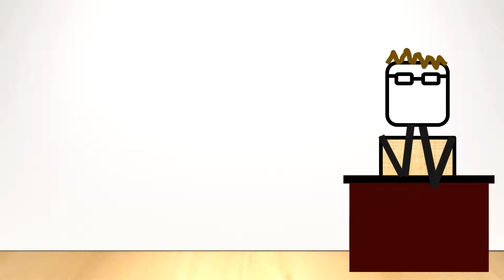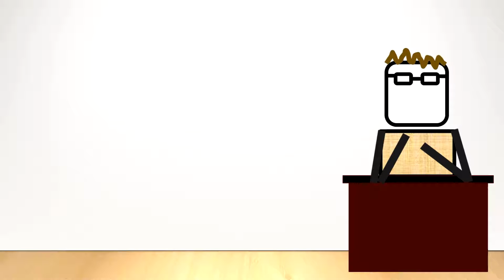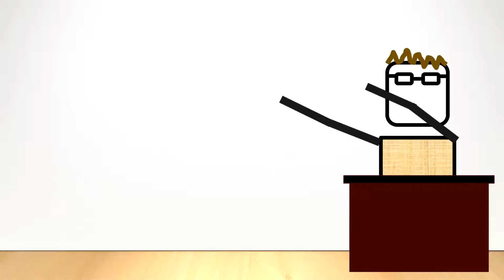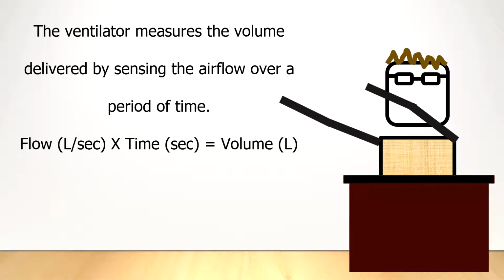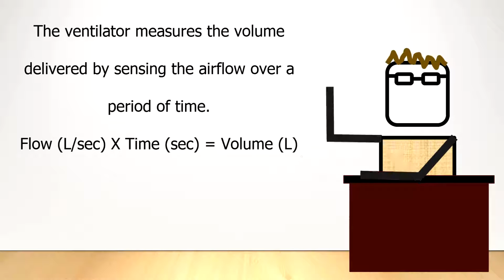Common teaching simplifies this as the ventilator can control either the pressure or the volume, because this is our common understanding, and the ventilator modes that we have frequently referred to either mention pressure or volume. In reality, flow is really the controlled variable when we're talking about volume control ventilation. Volume is in fact the measured variable.